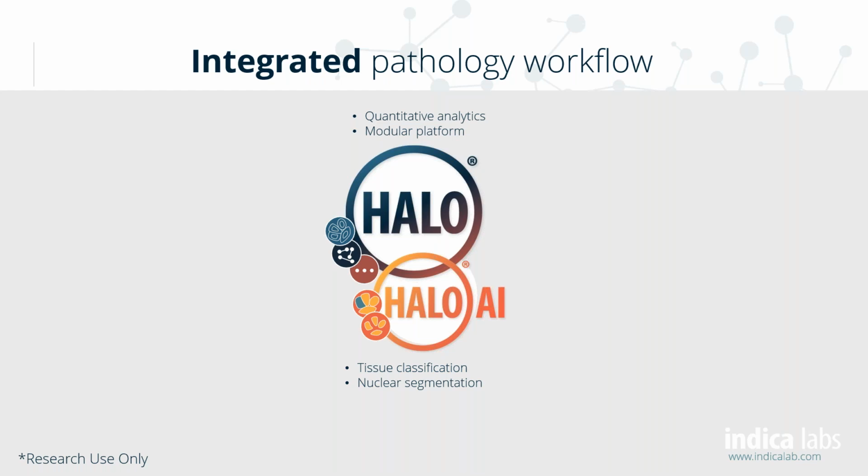So our users can save time. Our teams also have created AI apps, which are a suite of pre-trained algorithms tailored for specific needs. For example, identifying tumor cells or tumor tissue in different cancer types, such as lung carcinoma, breast, or gastric cancer.